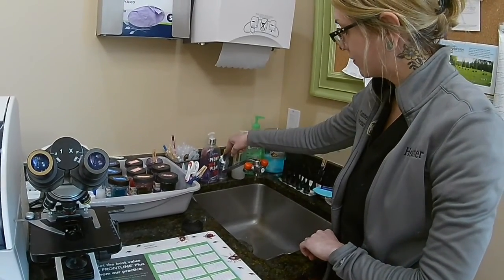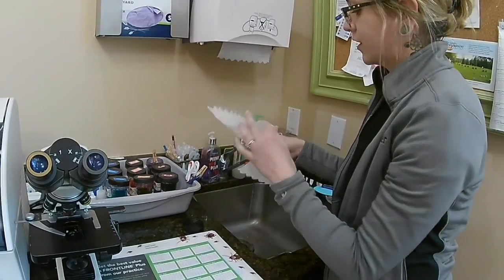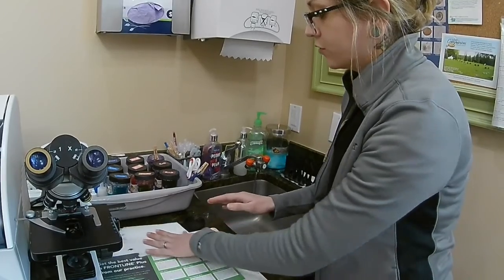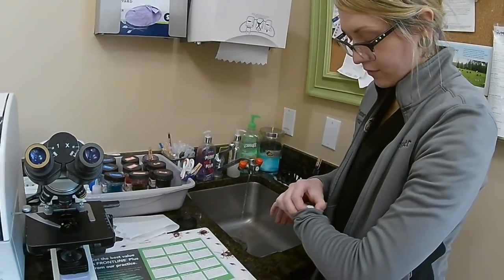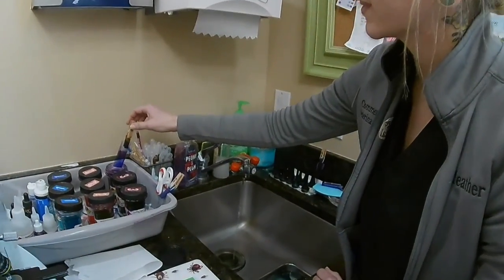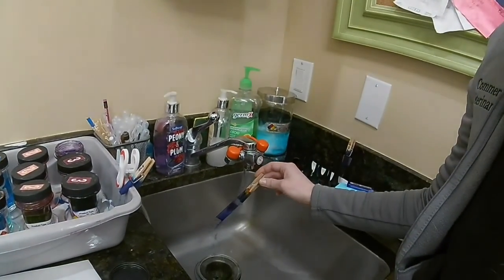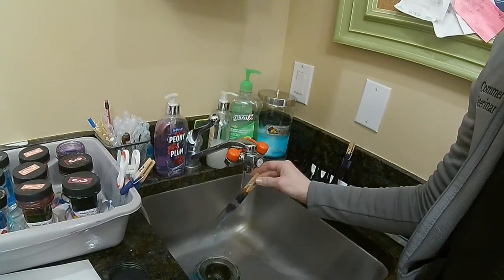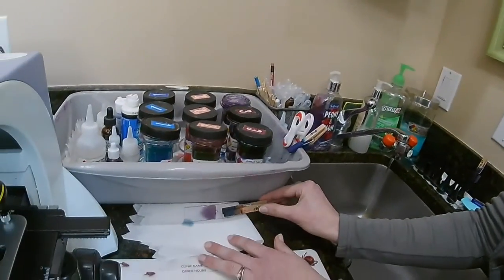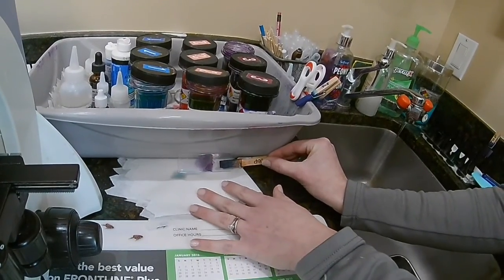A few more seconds here. Get set up, so I'm going to set my slide almost kind of vertical on there just to help the water drip off. And we're good. So I'm going to give her a little light rinsing. And then we are set up to let it air dry.